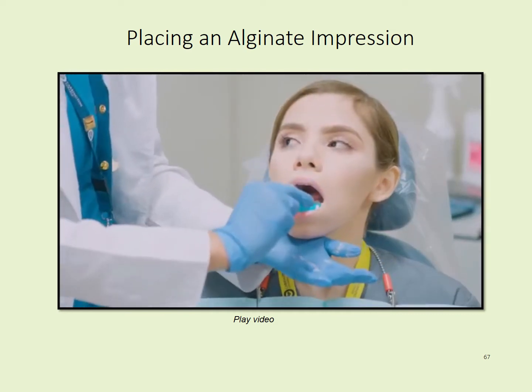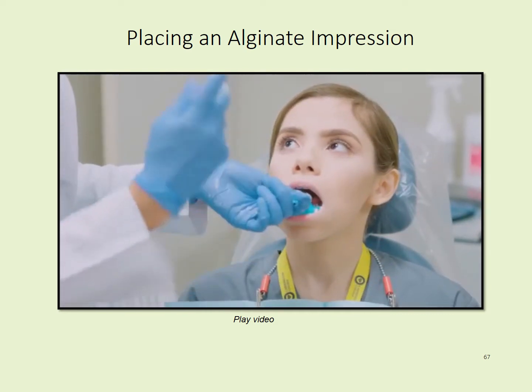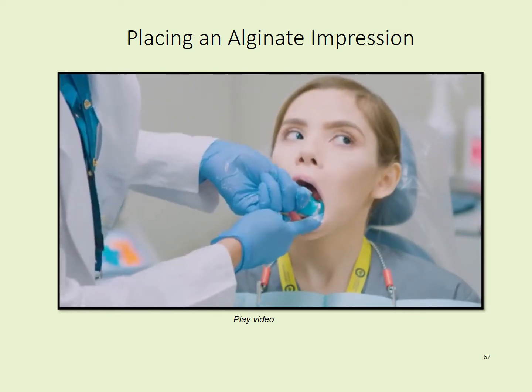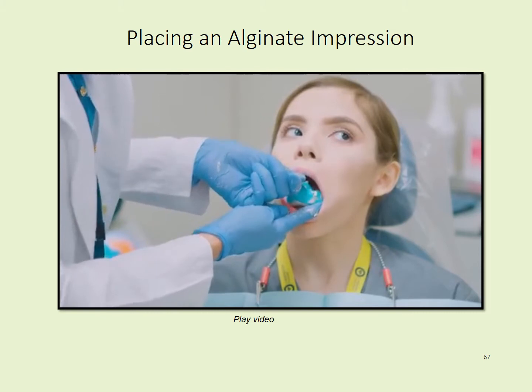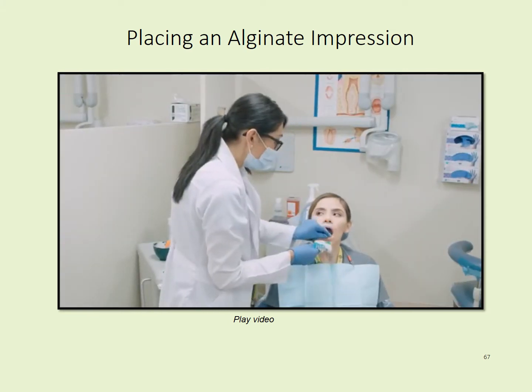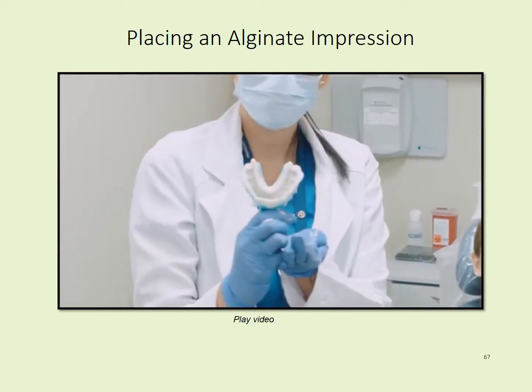I'm right-handed. I'm going to grab the tray like so, index finger, round the vestibule, find that air bubble, rock, and remove like so, and we have our impression.